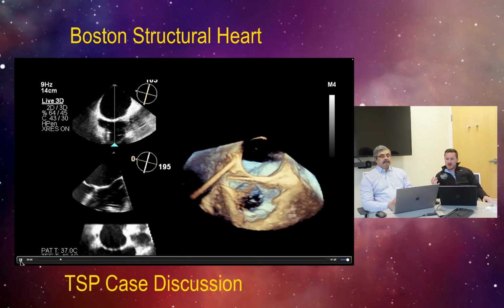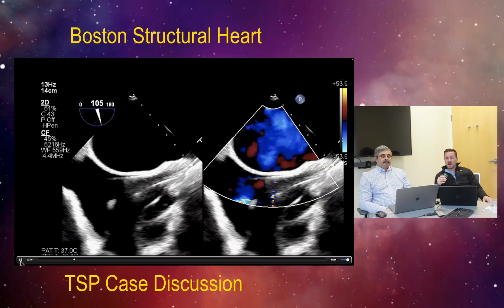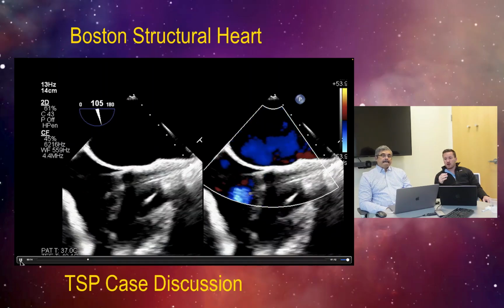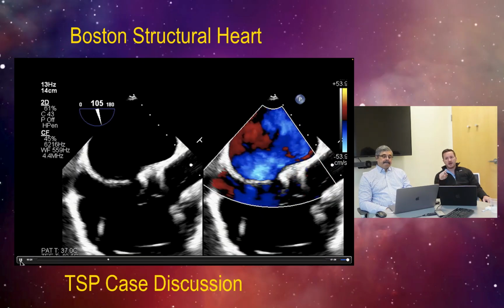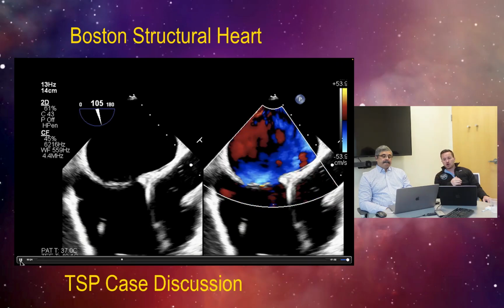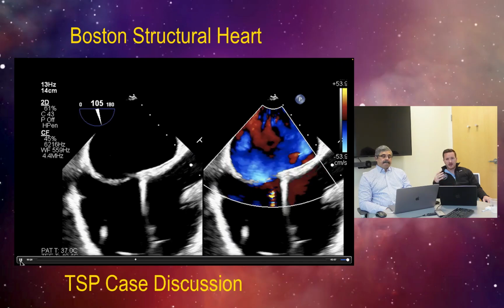So that is a quick series of images that I think highlights a couple of things. It highlights, first of all, that in certain cases like this, we needed to cross the septum in a very, very precise manner. In this case, at the site of the previous septal puncture. And then it also shows the various aspects of the PITLOC protocol in action.